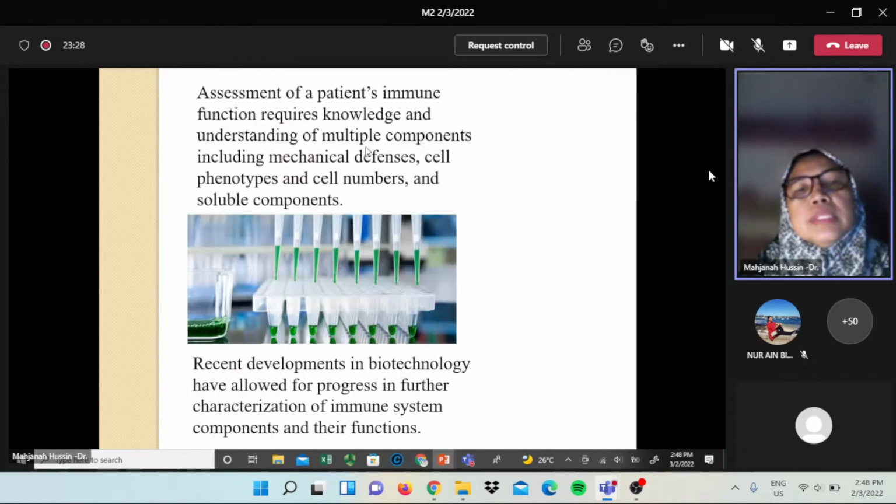All right, so this is just to show you how miniature it is. If you are doing serology, immunology, you do not require a big lab because everything is in a small quantity because it is very advanced. You are looking at the DNA molecular level of the protein, so it's not like the big bench with a lot of tubes.